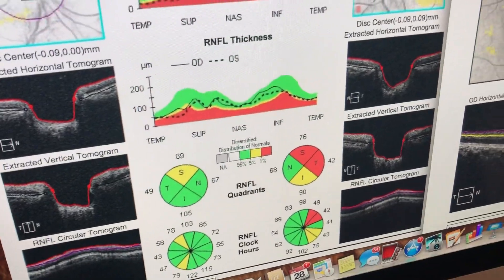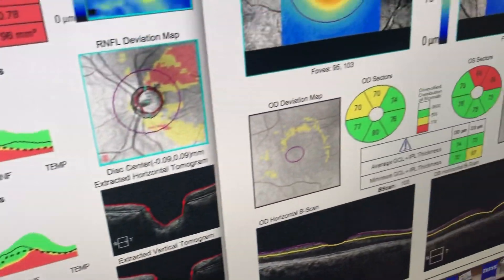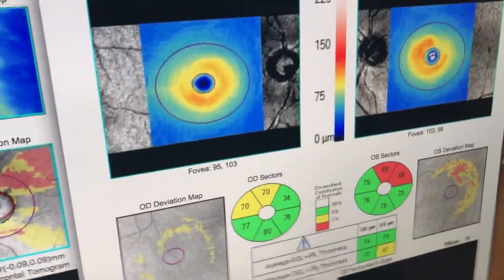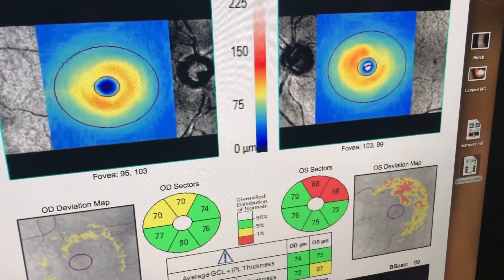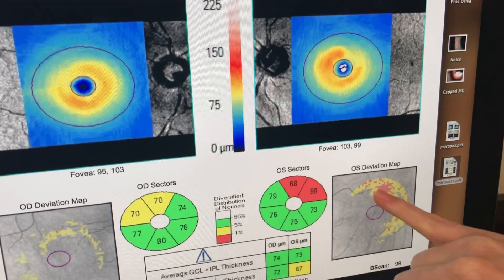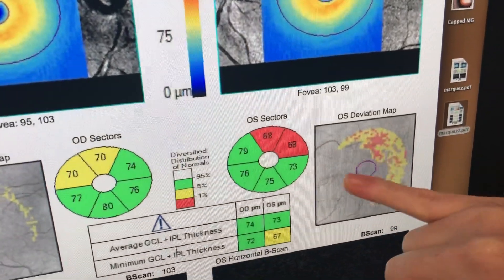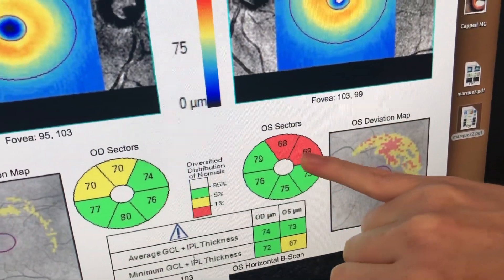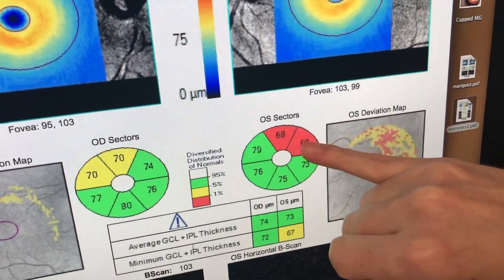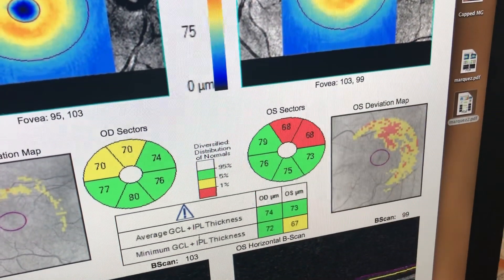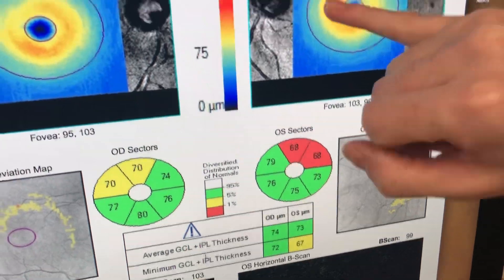Next I want to look at the ganglion cells — the cells that feed into those wires. Over here on the left you can see there's the superior temporal area taken out.